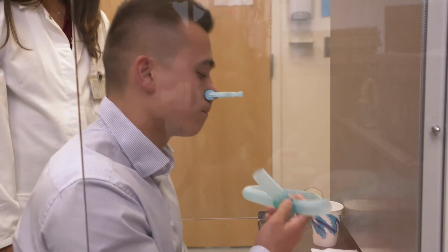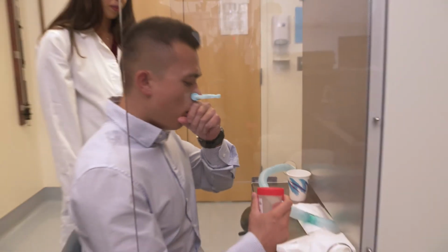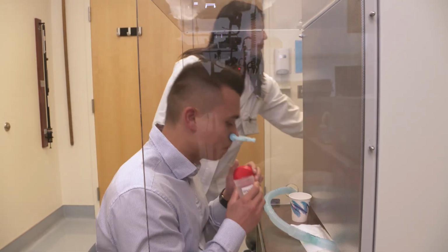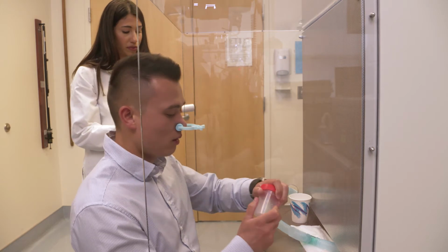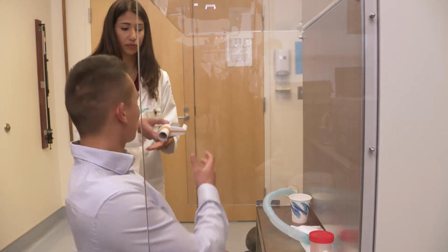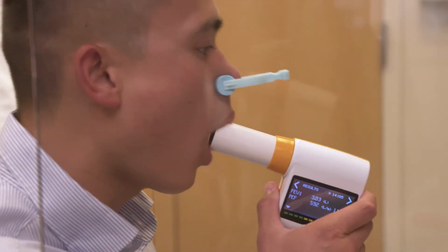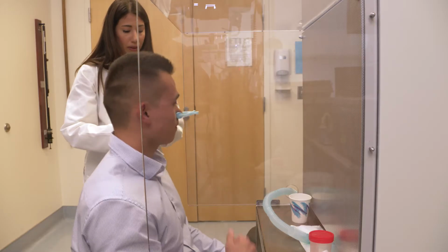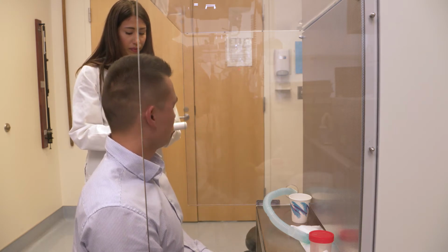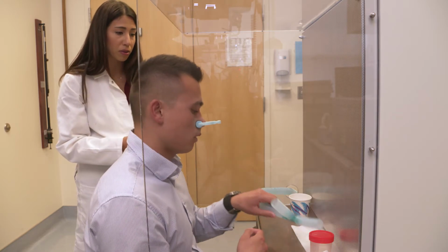Good. Now big coughs. Cough up anything that you can. Deep, vigorous coughs. Those are great coughs. Good job. Okay, we'll do a peak flow now. So big breath in and blow really hard. Good job. That was great. We can keep going. Return to breathing regularly on the mouthpiece.